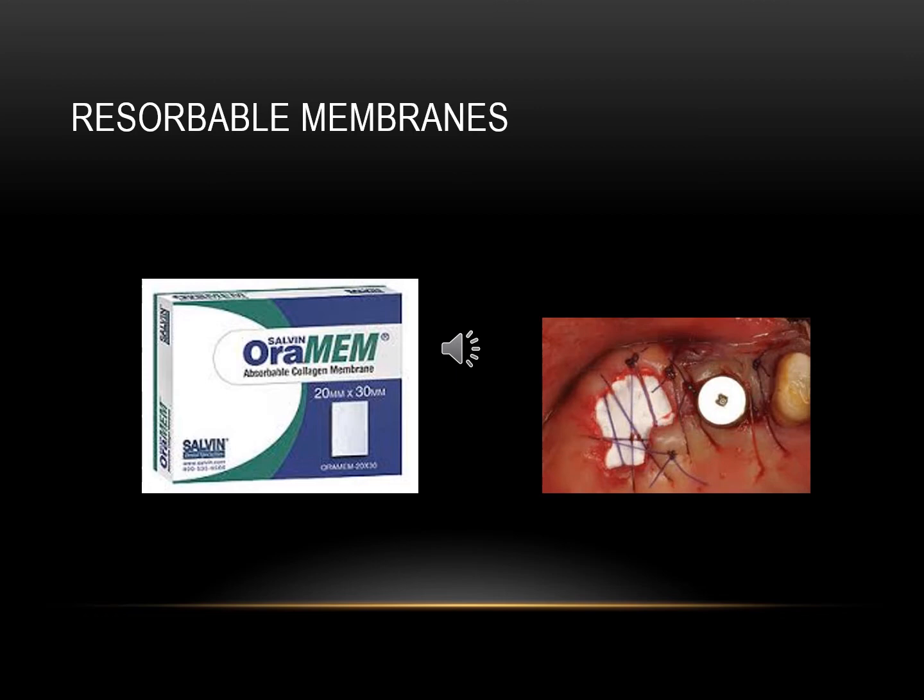After time of the bone formation, this membrane will resorb. The body will resorb this membrane, and there is no need to remove this membrane in another surgical procedure.